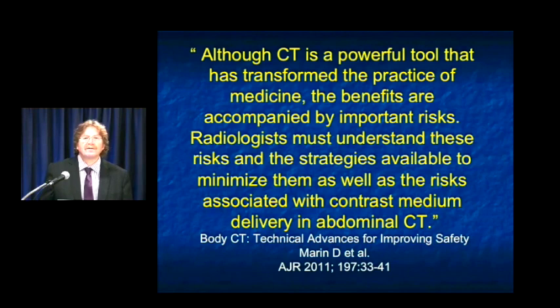Now, in terms of looking at risk reward, one of the things that then comes up is IV contrast material. To me, IV contrast is critical on every CT scan. There's no ifs, ands, or buts. I know stone protocols, no contrast, great. Otherwise, to me, IV contrast with fast scanners, multiplanar reconstruction, and 3D imaging is critical.